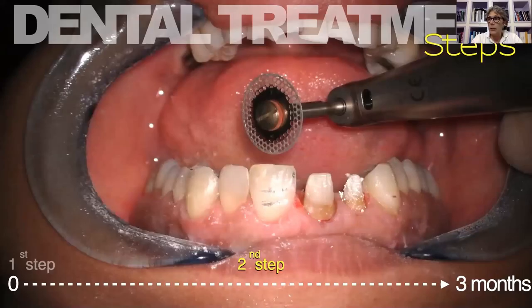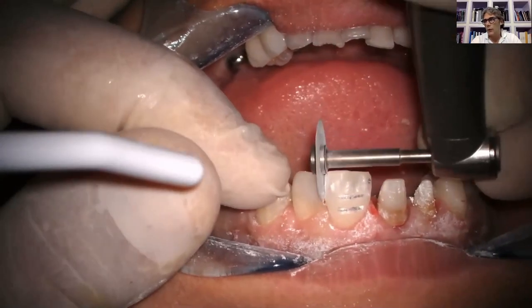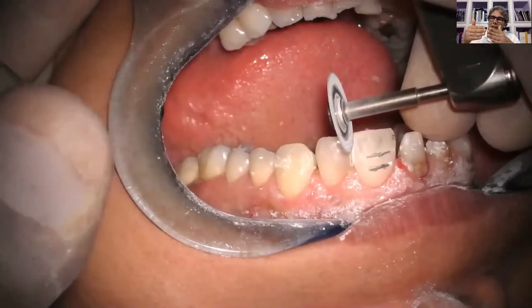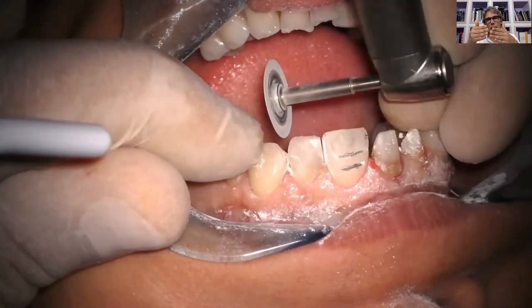In the subsequent step, I use this diamond disc to remove the interproximal contact between the neighboring teeth, and this is another important thing to do, because the scanner has to scan precisely the corner that I created after preparation between the buccal surface and the interproximal areas, in order to highlight the finishing line preparation in the interproximal area. We need to remove the interproximal contact between the teeth that we have to prepare.